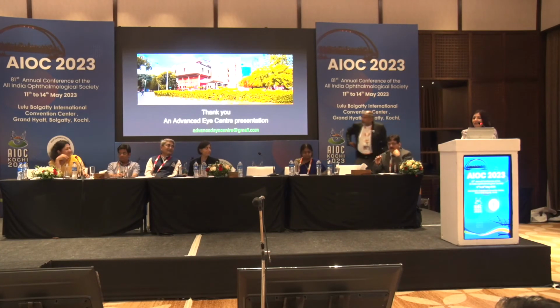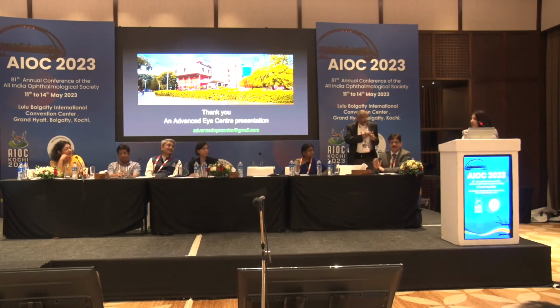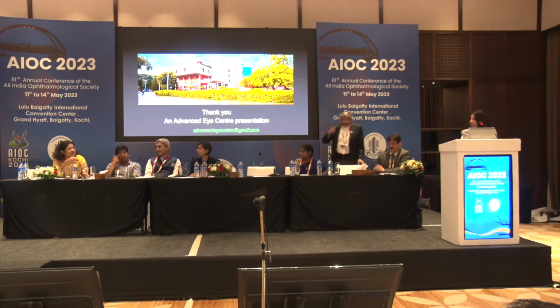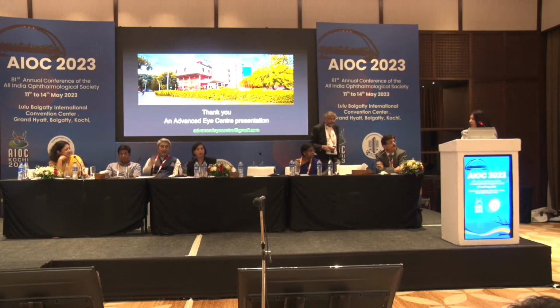Thank you so much, because it's the shaping and the sizing which is often a problem. It's always the edge which becomes a problem in such grafts, especially when you have all these different sizes and shapes coming in. It's the edge which makes a lot of difference. And you sometimes trim it and it becomes too short, and that's the problem.